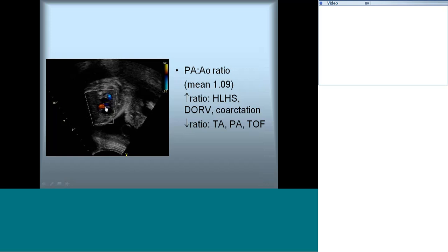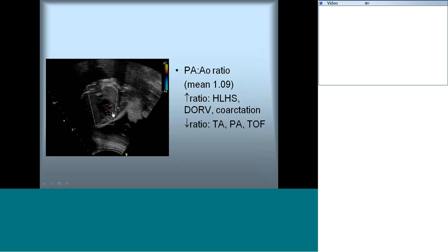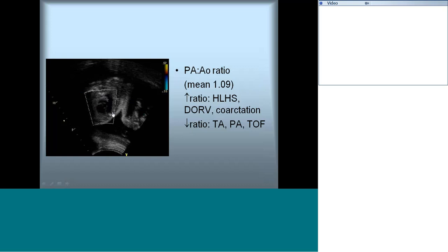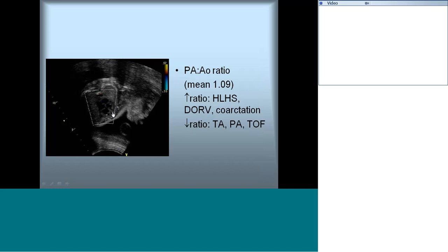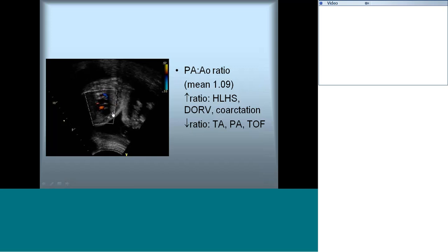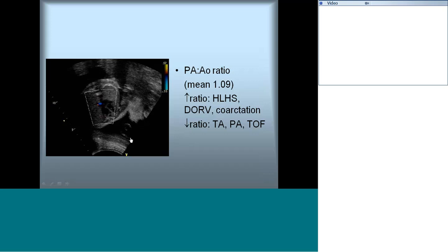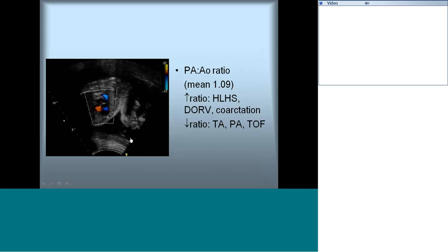False defects can sometimes appear in the membranous septum on four-chamber view, for which the parasternal long axis view is more important. The ratio between the pulmonary artery and aorta is important — normally the pulmonary artery is slightly bigger than the aorta, with a mean ratio of approximately 1.1:1 and a maximum acceptable of 1.2:1. If the pulmonary artery is much bigger, it could indicate developing coarctation or hypoplastic left heart syndrome. If the ratio is less — meaning the aorta is bigger — you could be dealing with pulmonary stenosis.